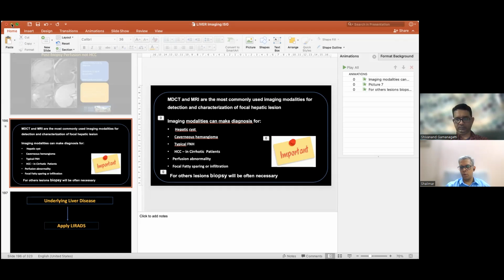Right. So we've got two similar questions. One from Prashant wants to know how the response to TACE is assessed, and similarly, when do we use the mRECIST criteria? Yeah, because of time I did not cover that.